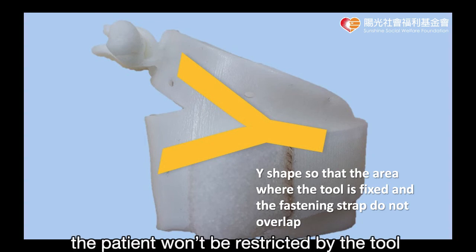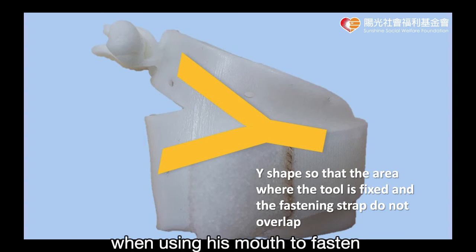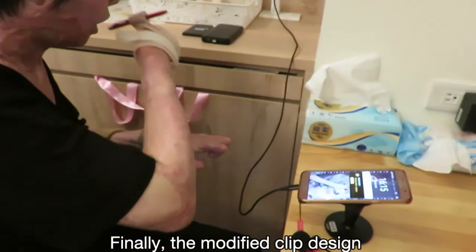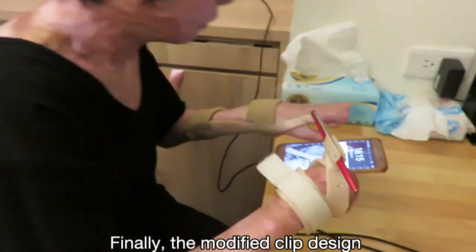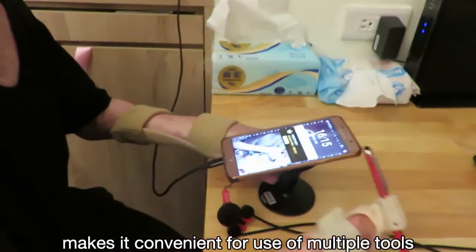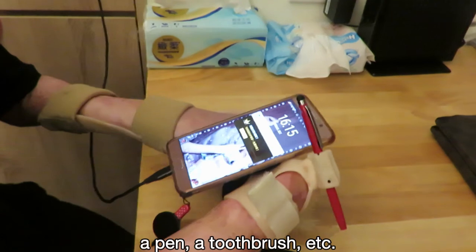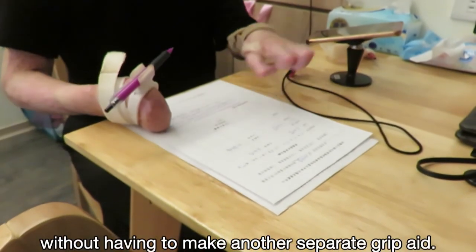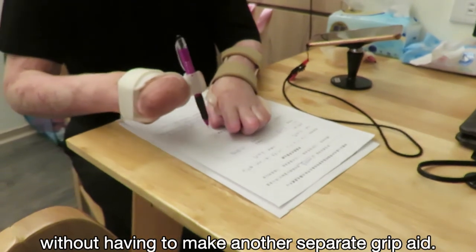The patient won't be restricted by the tool when using their mouth to fasten or open the non-adhesive velcro loop. Finally, the modified clip design makes it convenient for use of multiple tools — a pen, a toothbrush, etc. — without having to make another separate grip aid.